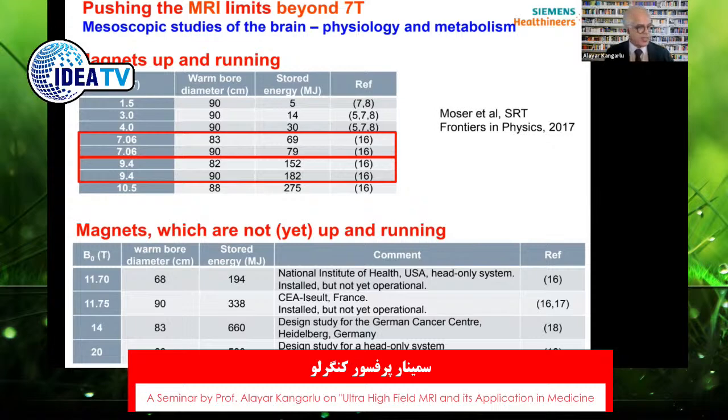Imagine all that kinetic energy being stored in the magnetic field in the bore of a 9.4 Tesla scanner. I believe that our 8 Tesla scanner back in 1995 had about 80 megajoules stored in it.